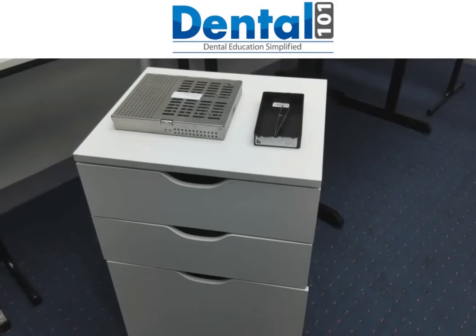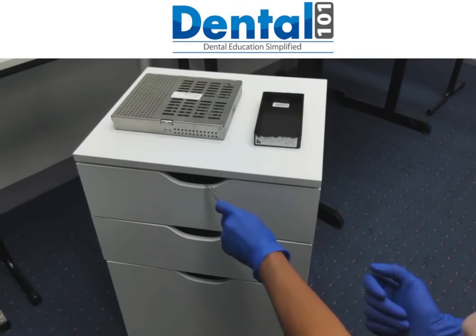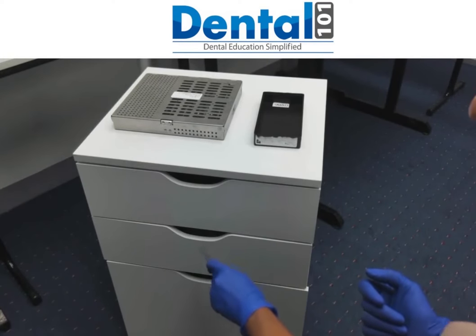This is a trolley that you will find in any furniture store across Australia, and there will be different sizes as well. The price is not too expensive, and I really encourage you to get one because it will make your life easier. Usually you put it on the side and you work with a transfer tweezers and you'll be able to retrieve whatever you need clean from inside your drawer.